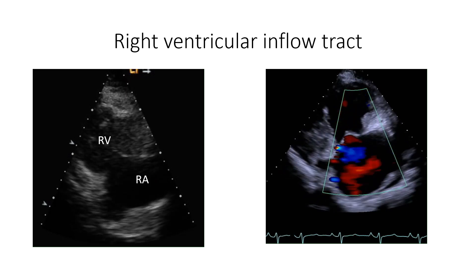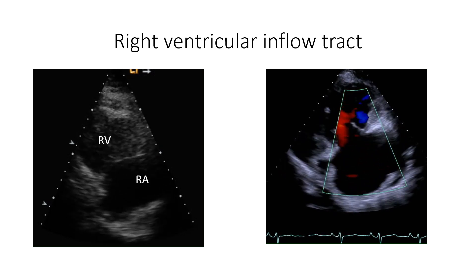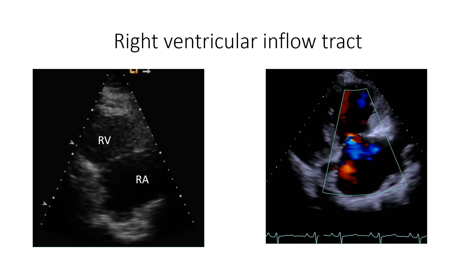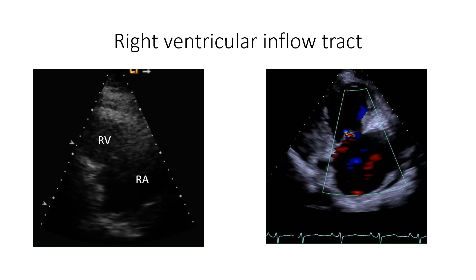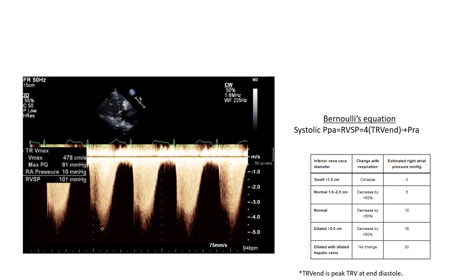This is the right ventricular inflow tract in the long axis view. Here you can visualize the right ventricle and the right atrium. The tricuspid valvular apparatus is also seen. This view allows us to visualize the tricuspid velocity and provides an assessment of right ventricular systolic function. Tricuspid velocity is the difference in pressure between the right ventricle and the right atrium. When pulmonary stenosis is absent, the right ventricular systolic pressure is assumed equal to the systolic pulmonary artery pressure, calculated using Bernoulli's equation with estimated right atrial pressure from the inferior vena cava diameter.